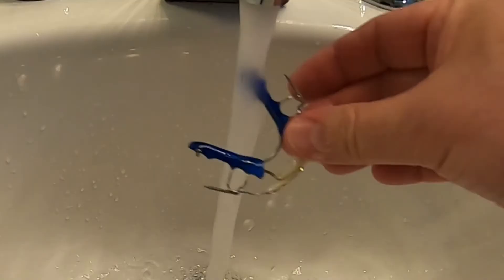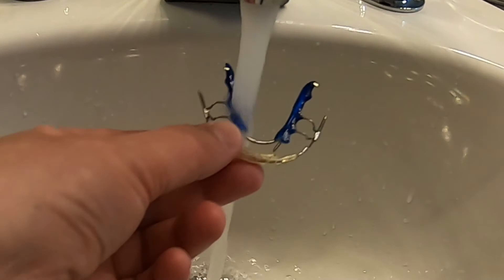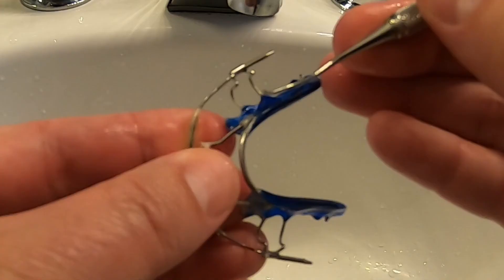To take care of it, I rinse it off in water when I remove it from my mouth in the morning and brush it with my toothbrush. I don't use toothpaste since it will scratch the acrylic. As you can see, it is getting some tartar buildup on it — from time to time I'll scrape the tartar off with a dental scaler.